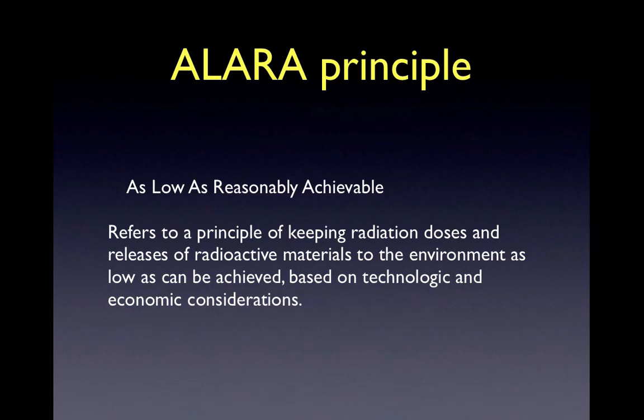As I conclude this lecture, I'd like to take a brief moment to discuss the ALARA principle. ALARA is an acronym, and it stands for as low as reasonably achievable. AIUM, the American Institute of Ultrasound in Medicine, adopted this acronym. The term reminds us, as physicians, sonographers, and operators, that the amount of time for an examination, along with the equipment and the settings, all contribute to the prudent use of diagnostic ultrasound. We want to minimize any risk, any exposure to our patients, as low as reasonably achievable.